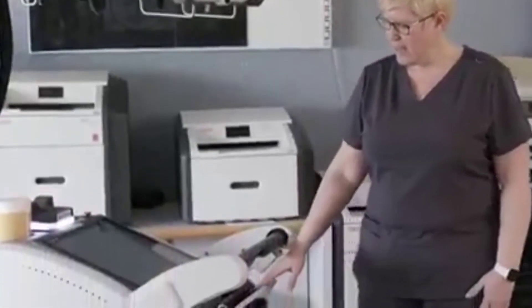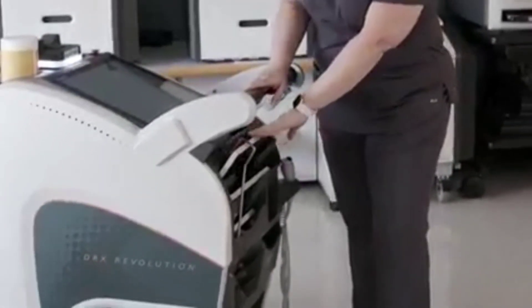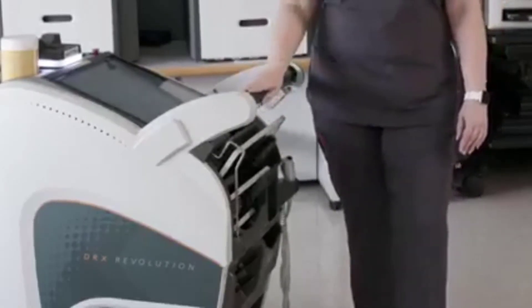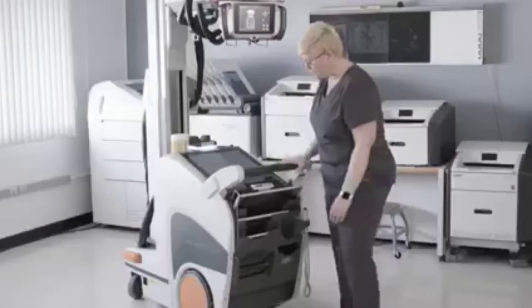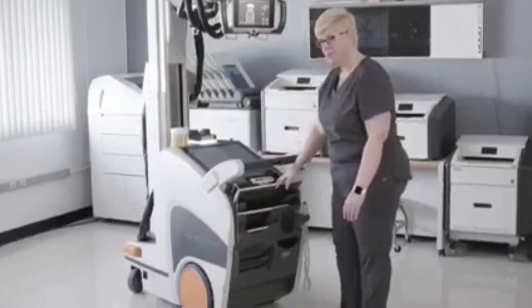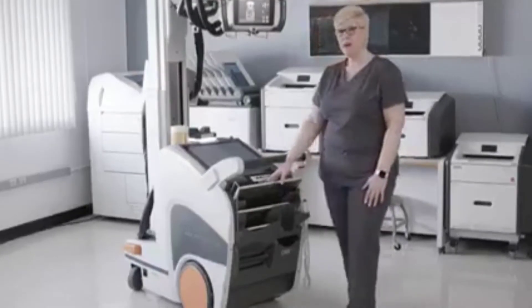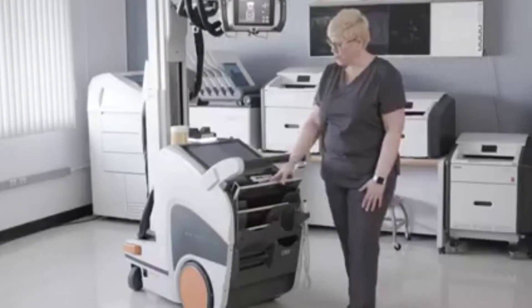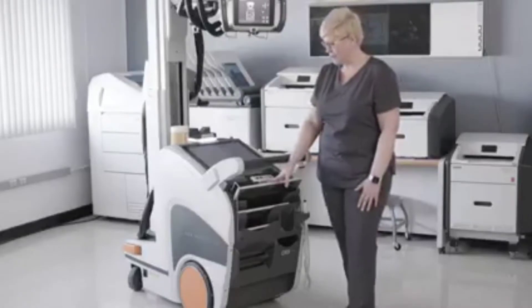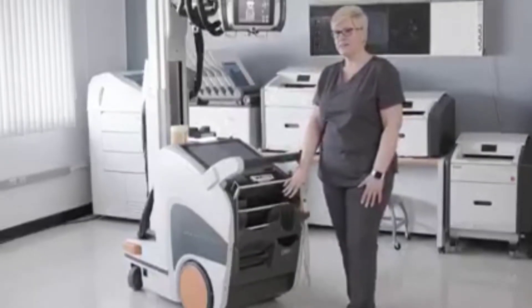The bin on the Revolution system has been redesigned. It now offers an optional detector bin lock, which eliminates the detectors from walking away when the Revolution cart is left unattended. We also allow you to store all three detector sizes — the 4343, the 3543, and the 2530 detectors — all at the same time. The first slot in the bin allows you to both store and charge either the 3543 or the 4343 detectors. At the bottom of the bin is a slot that allows you to store and charge two spare detector batteries.